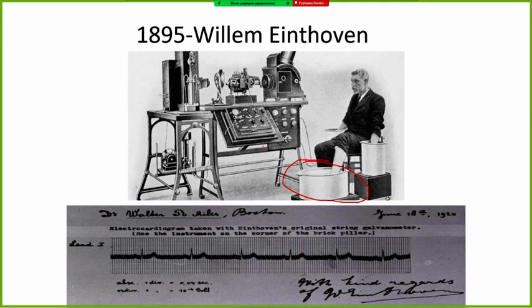He needed buckets in order to increase the electrical conductance between the body and the ECG recording machine, because the salted water increases electrical conductivity.